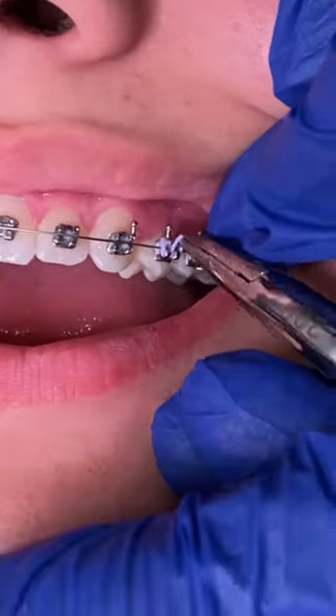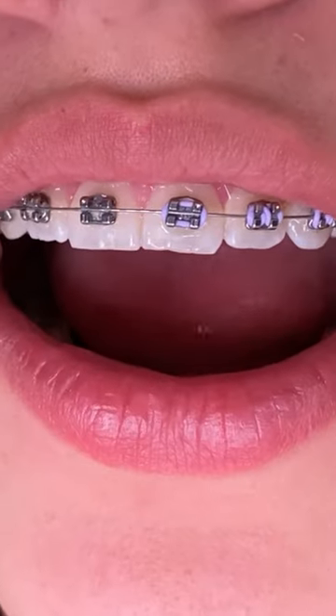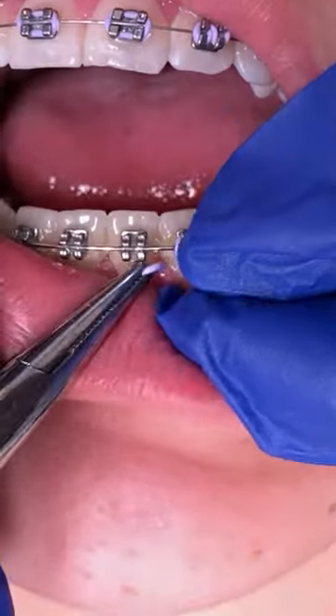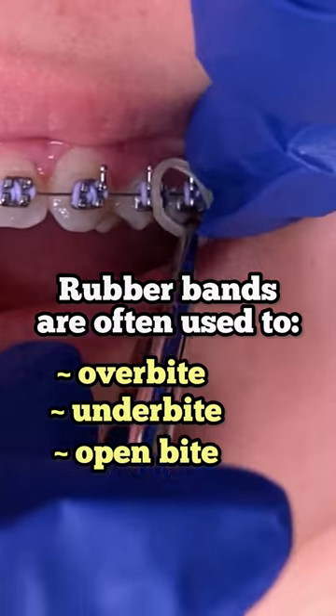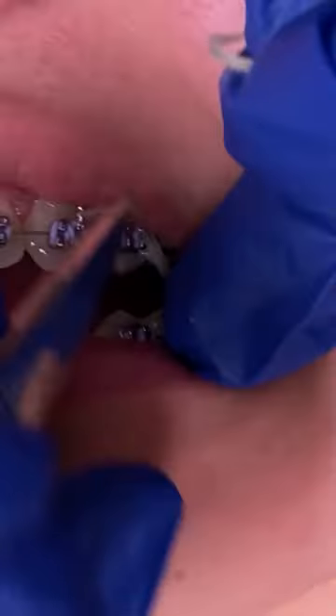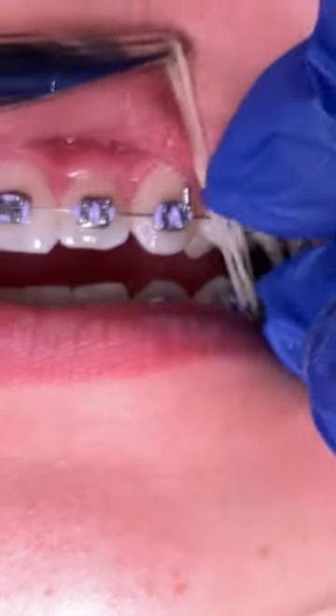A lot of questions are always asked: why do rubber bands have to be used? Rubber bands are used to help with any crossbite, overbite, or underbite — really to adjust your bite or occlusion. What you can see right here, this patient is being placed some elastics to wear. These are what we call post-closing elastics.